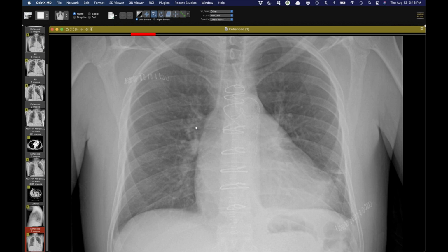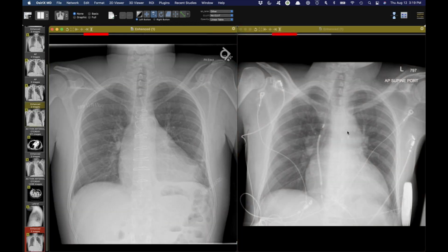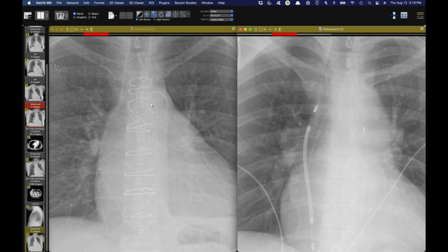So I have not seen that as a complication of an intra-aortic balloon pump. I haven't really had time to even search the literature to see if it's been reported. I'll put up that radiograph again, because you can see, as you said, just abnormal widening here. There's rightward deviation of the trachea. You've lost your AP window, and there's just too much stuff in this area, probably displacing the left bronchus a little, flattening it out too. So, yeah, it's very curious. I've never heard or encountered that kind of injury myself.